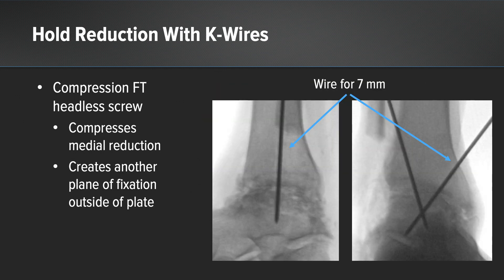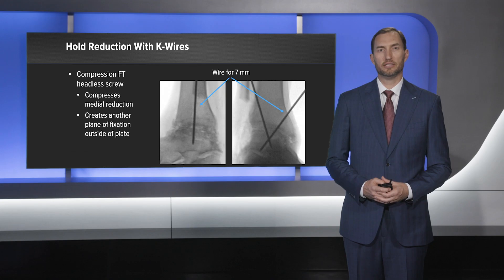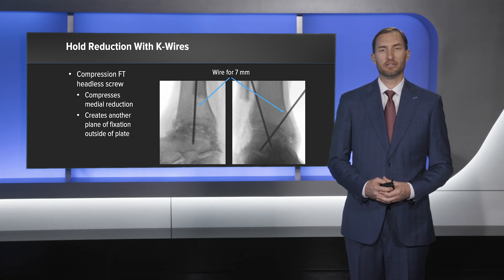I held this reduction with K-wires. When you're placing the medial K-wire, it's important to remember that this can be the K-wire that guides your 7mm compression FT headless screw. The screw provides compression medially and gives you another point of fixation outside of the plate.